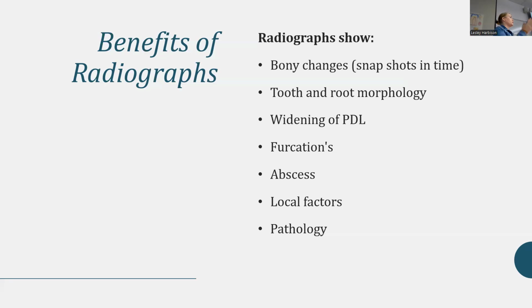So you can mark those changes with a series of radiographs. Tooth and root morphology, the anatomy, the curvature, the landscape, you can see with different angles and different types of radiographs too, like CBCT scans that show more 3D anatomy.